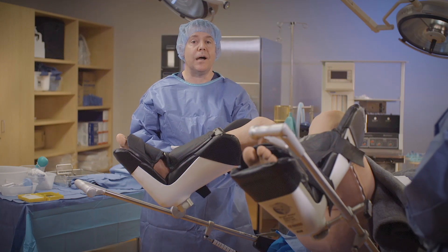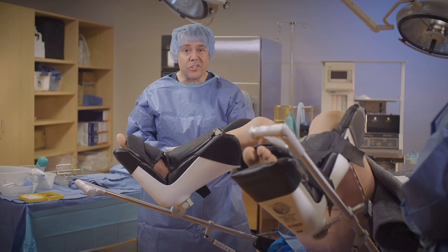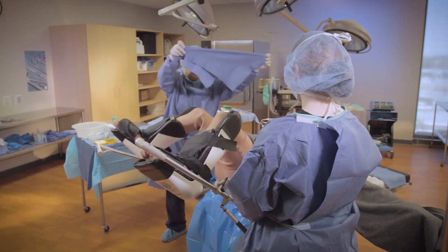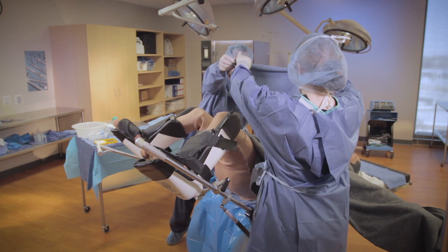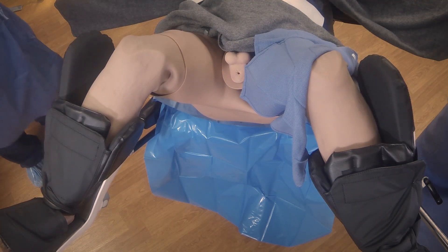Next we're going to grab two towels that have been prepared ahead of time and we're going to outline the surgical site. One drape to my surgeon, one drape for me.